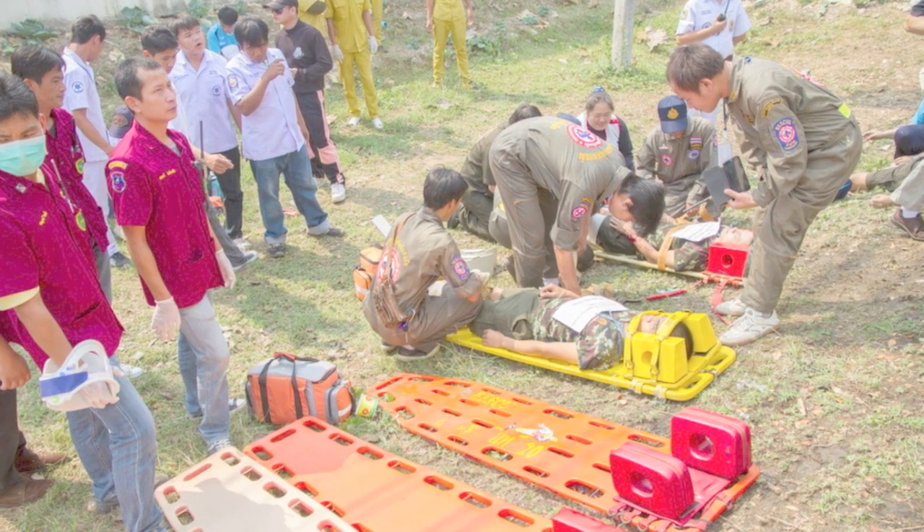Today, the typical stapler weighs just a few ounces, and you, survival medic, will be using them for skin. Staples look and act much like office staples. They work by pinching the skin edges of a laceration together. They may be used on the skin of the abdomen, extremities, scalp, back, lots of different places, but are less appropriate for use in certain areas like the neck and face, and maybe some areas of the feet and hands. Stapling is pretty much the preferred method of closure for trauma care these days, especially if mass casualties are involved in everything from natural disasters to car crashes, and this is partly because they can be placed so rapidly.